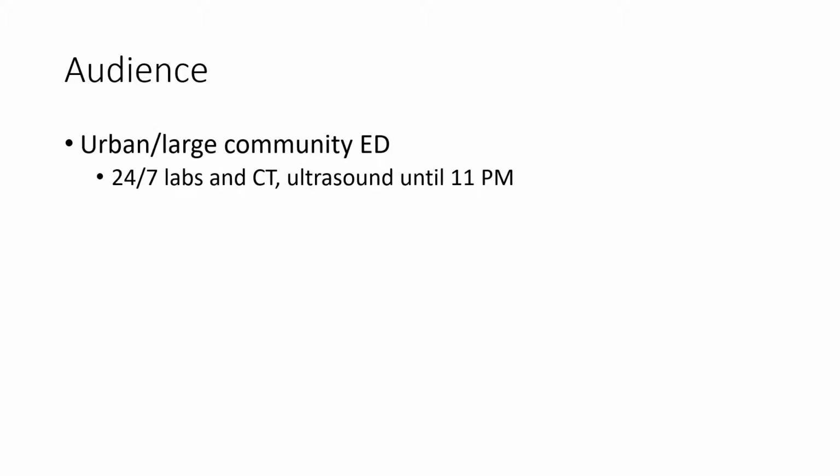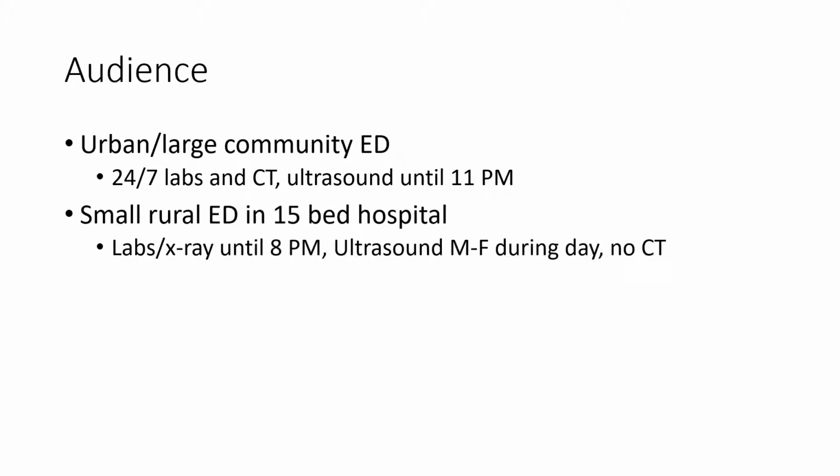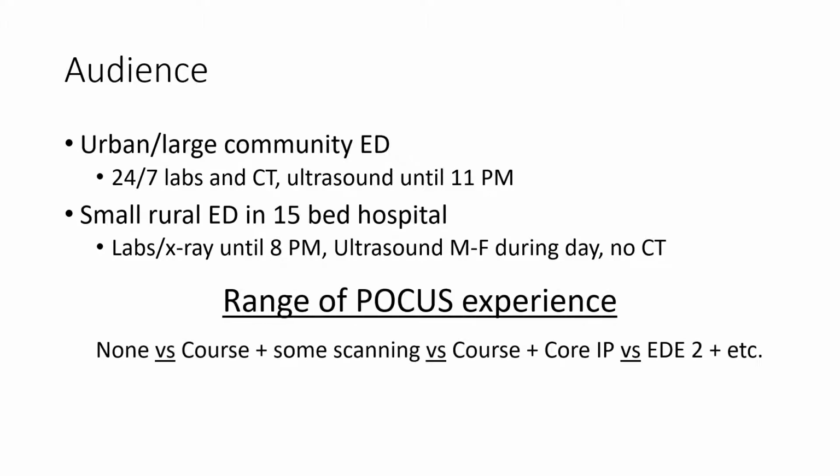I just wanted to highlight that you, the audience, have different backgrounds and work in different settings, so your objectives may vary. Some of you may be physicians working in large urban community emergency departments with 24/7 access to labs and CT scan with elective ultrasound available until 11 p.m. Others may work in a small rural ED with labs and x-ray available only until 8 p.m., elective ultrasound only available during the week, and no CT scan. Also, I am assuming a wide range of POCUS experience, from none all the way to the advanced user. I think this presentation will be useful for everyone.